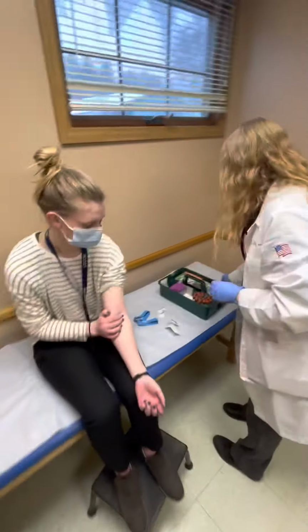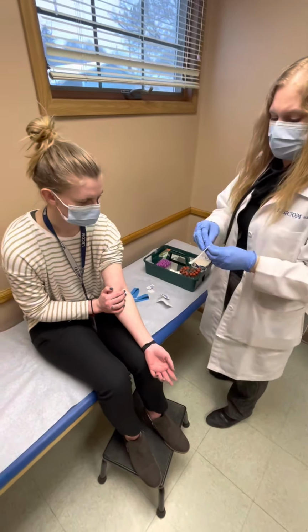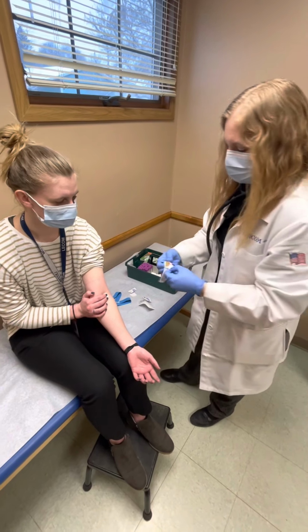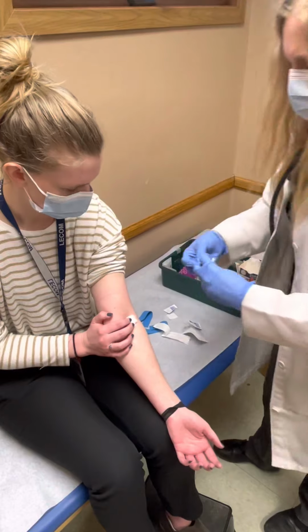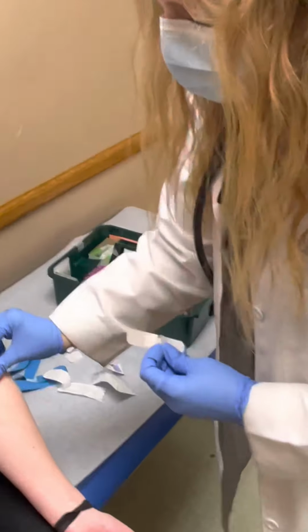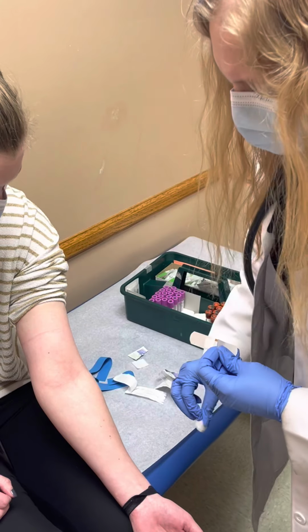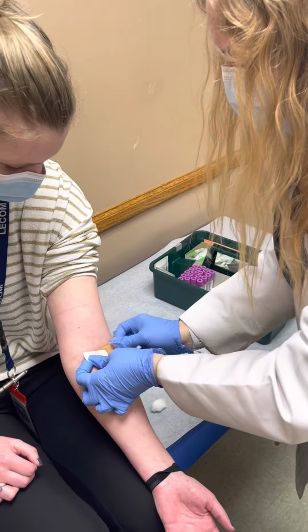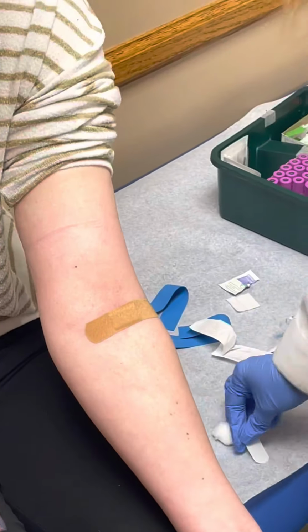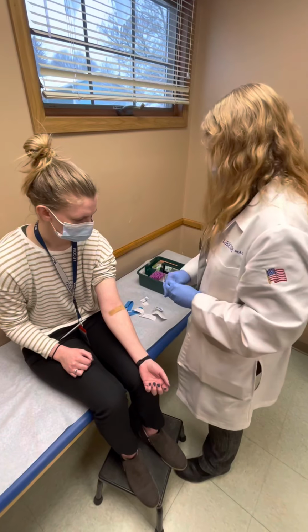Okay, and then the second hardest part. The first hardest part is the tourniquet, the second one is the Band-Aid. Putting a Band-Aid on seems super easy, not so much when you have gloves on, all right? So she's been holding this now for 10 to 30 seconds. You're going to check and make sure that she's not bleeding anymore. And then we're going to apply our Band-Aid. Some people apply a Band-Aid over the cotton ball. I don't do that because these cotton balls are so big that the Band-Aid's just going to pop right off again, okay?